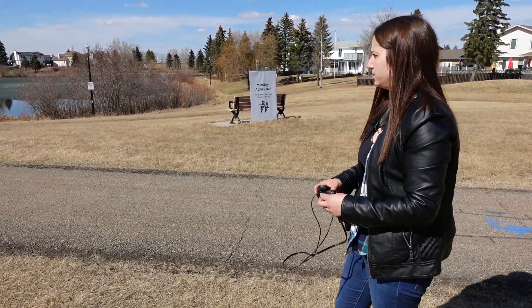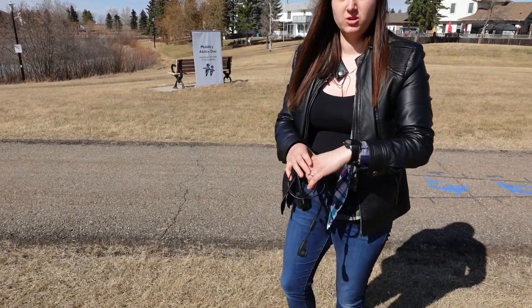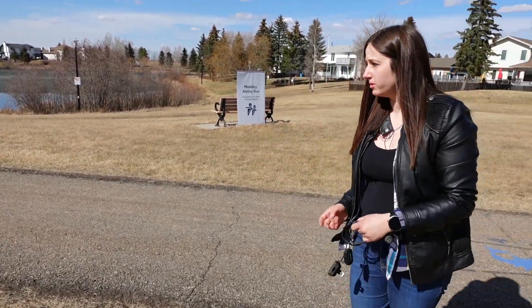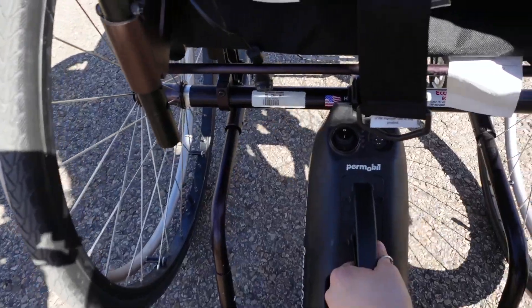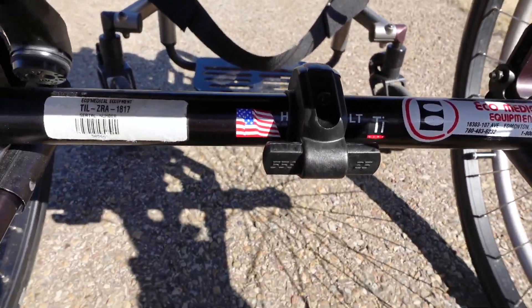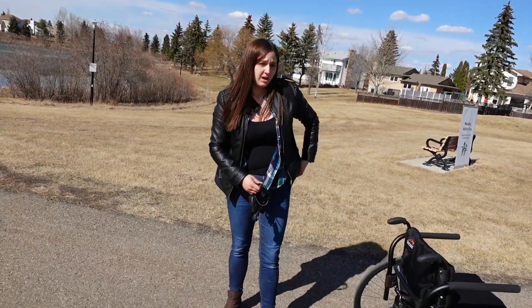I feel like the dial personally is a little bit better. Well, I like the dial as well, but the watches are pretty neat too — a lot of younger, tech-savvy users like those. And not only that, but going forward you can use a Samsung Galaxy Watch as well, or an Apple Watch, which most people already have. This is really nice — it's also on your phone, which everybody has. The bracket that mounts on there is just a little bracket. You turn it off, lift up, and you've got a little bracket that you just mount onto the chair. You don't necessarily have to use a rigid chair — you could also use a folding chair. It comes with different brackets for different models of chairs, so anybody could use it really.